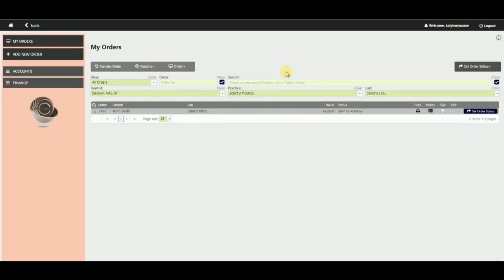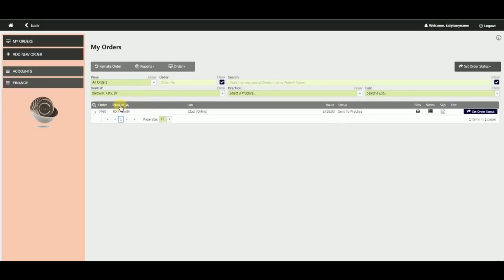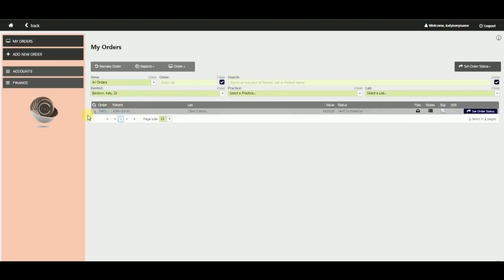Once you have built an online case list, you can sort your cases by patient name, value, or order status. You can expand each case to view the key details.